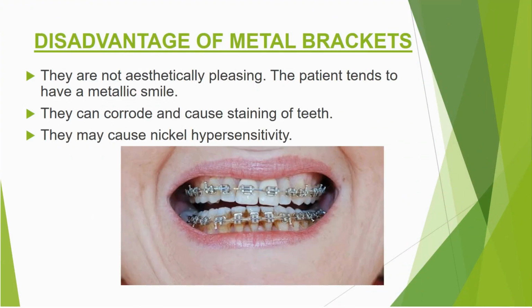Disadvantages of the metal brackets. They are not aesthetically pleasing. The patient tends to have a metallic smile. They can corrode and cause staining of teeth. They may cause nickel hypersensitivity. In this picture, we can see how the teeth are stained because of metal brackets.